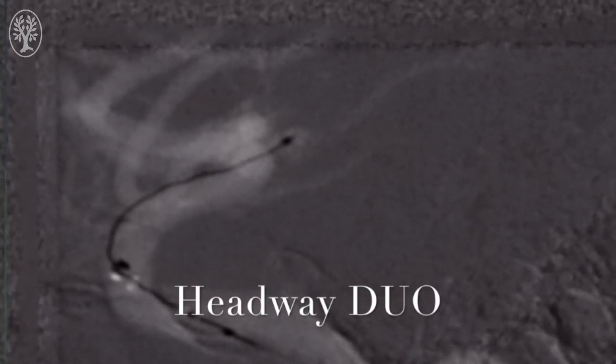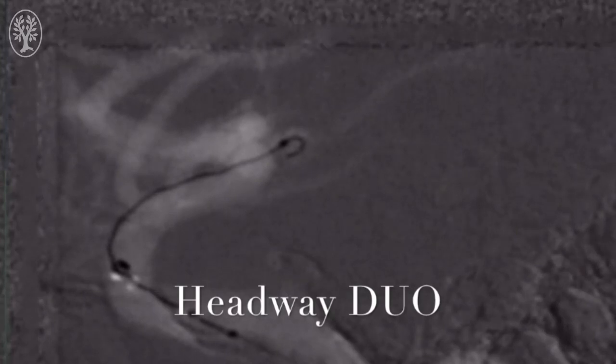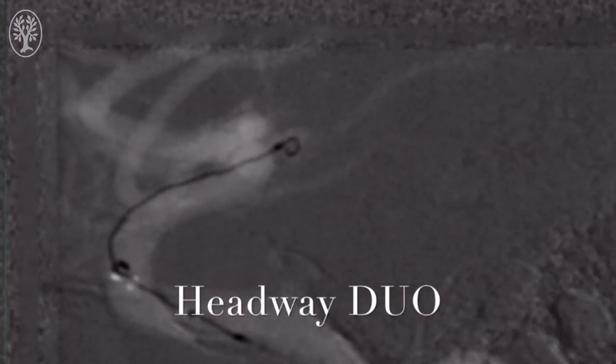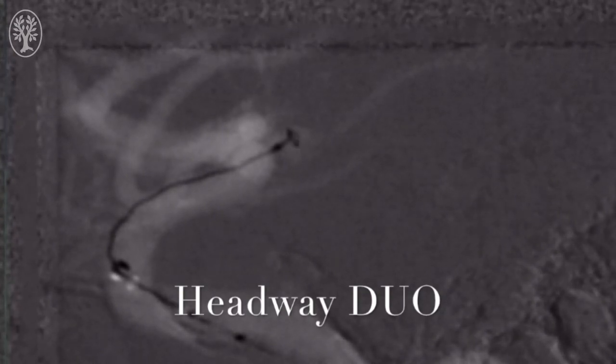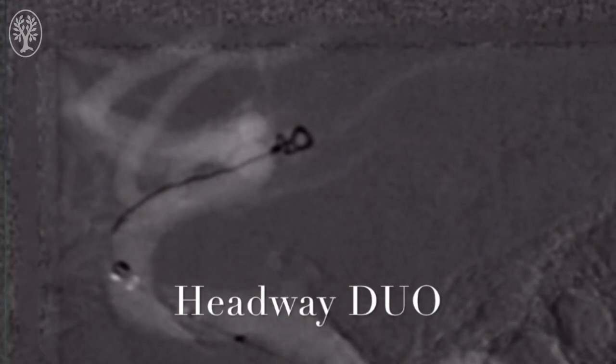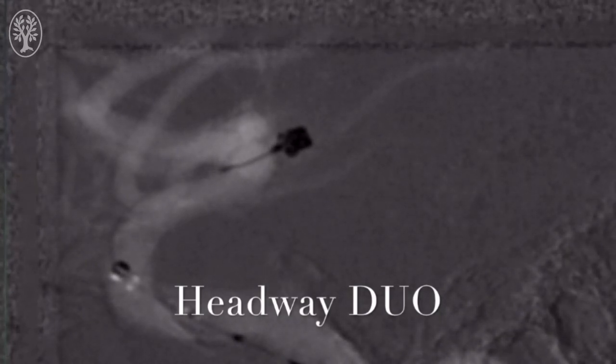Now we bring up a similar coil and slowly coil the aneurysm. You can see how much more stable this catheter is in this position. We finally bring up our finishing coil.